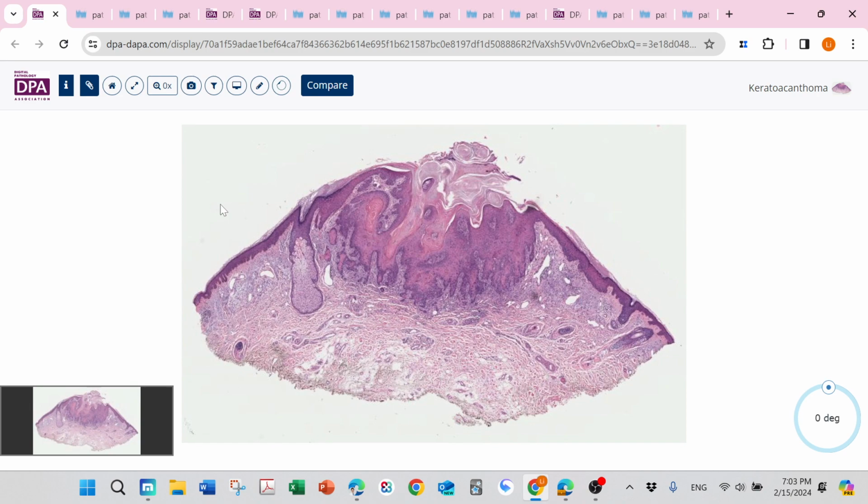I'm going to skip the traditional classic squamous cell carcinoma because I know that when you see the diagnosis, you know that it's squamous cell carcinoma. Here is a variant of squamous cell carcinoma, keratoacanthoma type. If this is a true keratoacanthoma, usually we don't need to treat this kind of lesion because this lesion classically grows really fast, and then it will regress by itself.